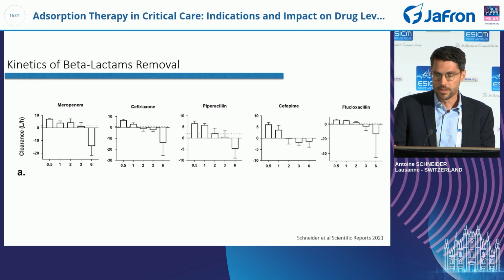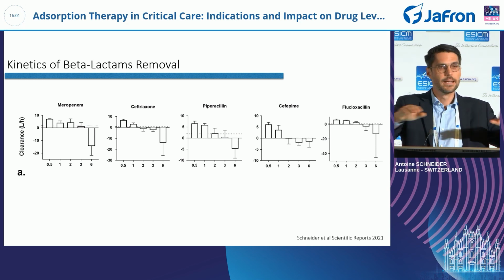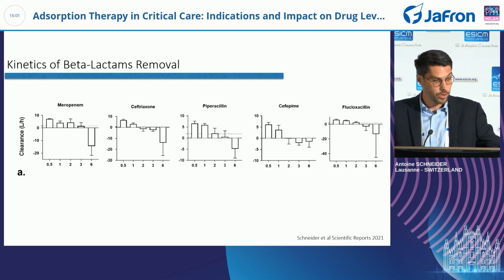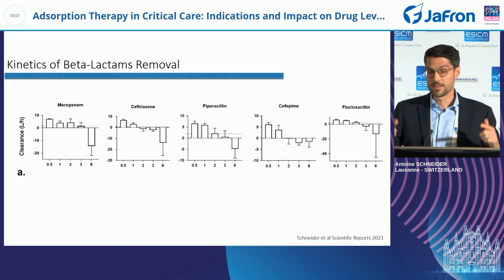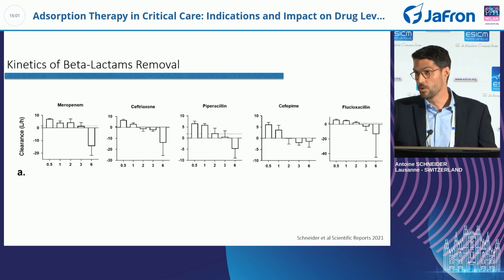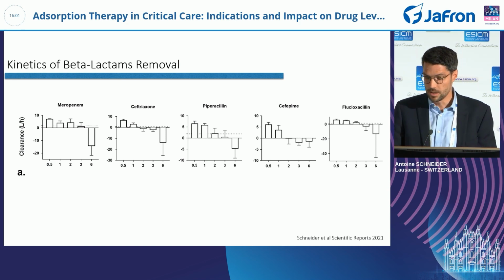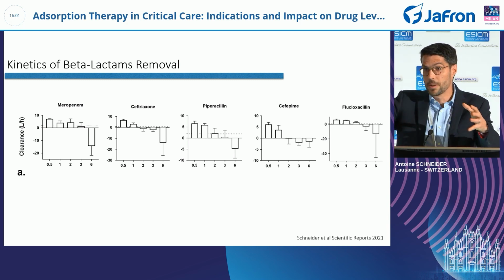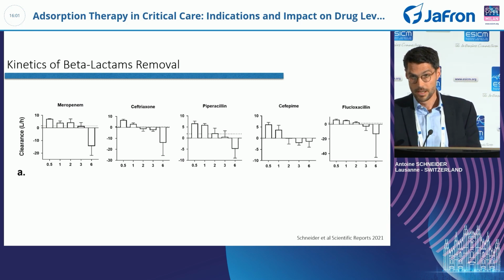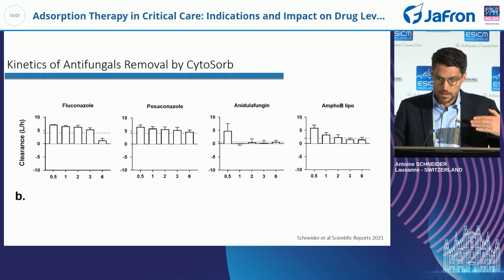I think that's very interesting because it's not something that is linear. You put the adsorber and then you have a certain removal every hour? No, no, no. The first hour, you look at here, these are the beta-lactams. The first hour, there's a huge removal, and this is slowly sloping down, decreasing over time, with even desorption in the 6 hours. The study was conducted for 6 hours. So the molecules were sticking, and after a certain amount of time, they were being released in the blood, leading to a negative clearance.